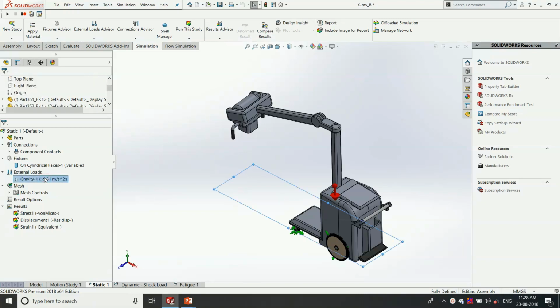Then I applied gravity as an external load. So in this condition I am very concerned about whether, due to the gravity, the X-ray machine head can withstand the stress or not, or whether I need to place any harder pole to support the X-ray machine head. So then meshing the model.